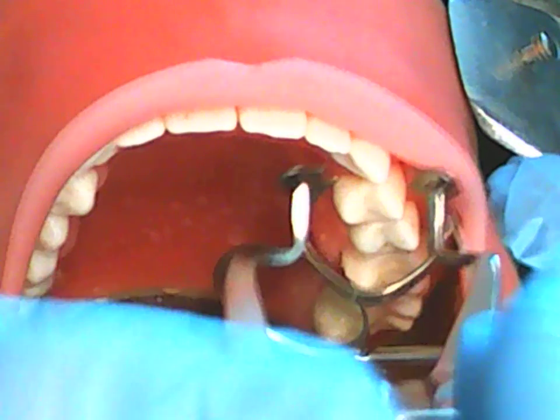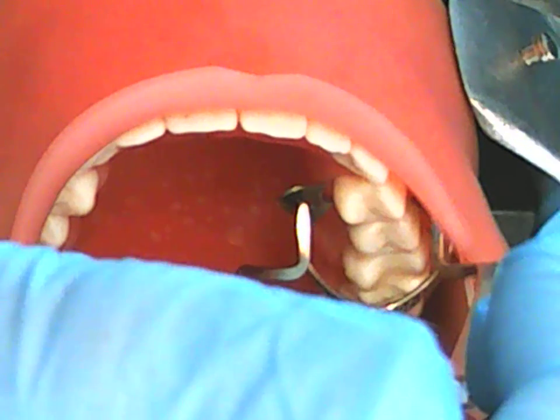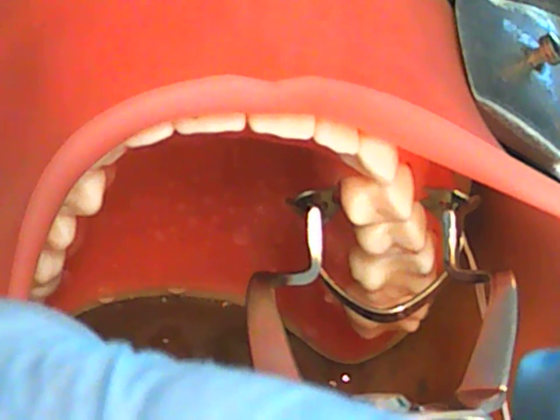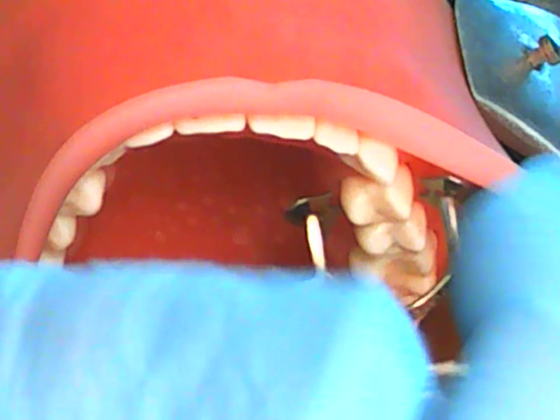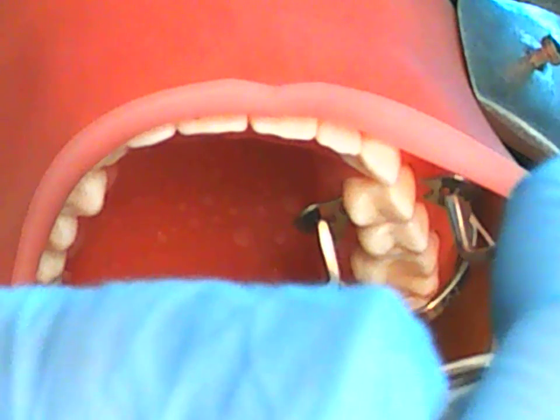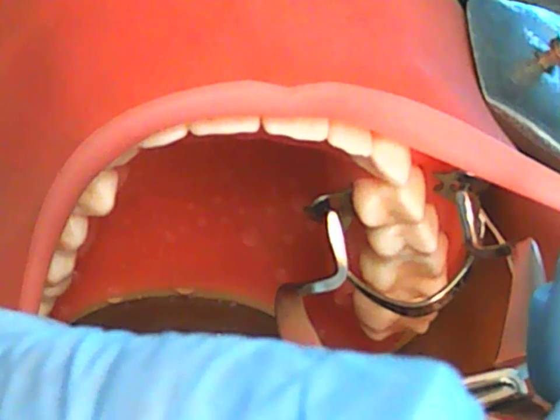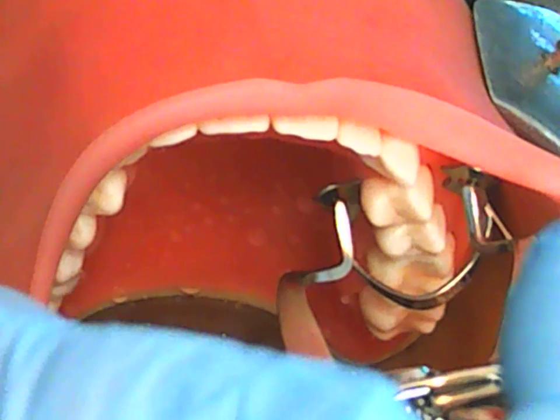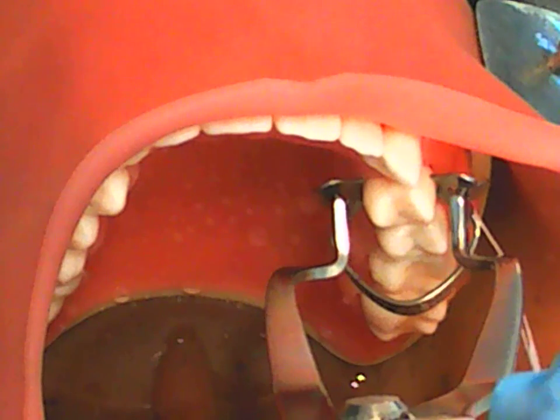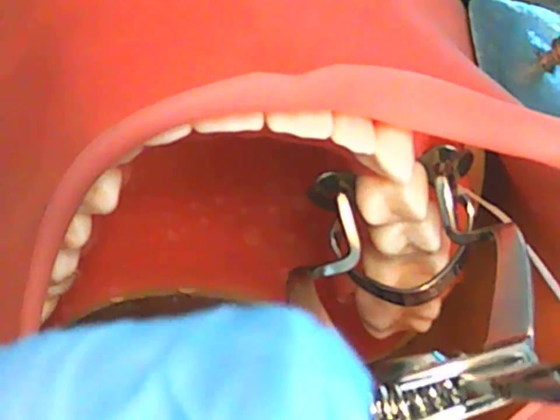What I'm doing is placing the clamp. There we go. Good job. I'm having the clamp stretched quite a ways around the tooth. Go over the entire surface. Put the prongs towards the lingual aspect of the tooth, slide the clamp over that height of contour until you feel resistance, and then slowly release on and slide down the buccal and do the same. You should feel resistance.